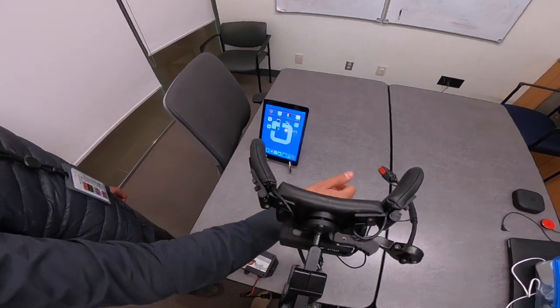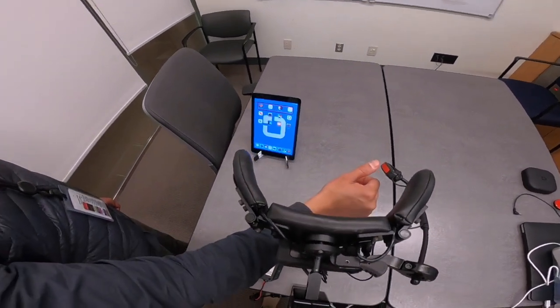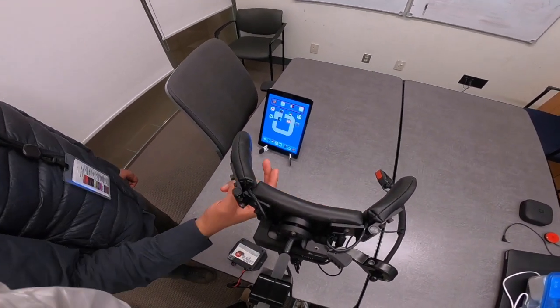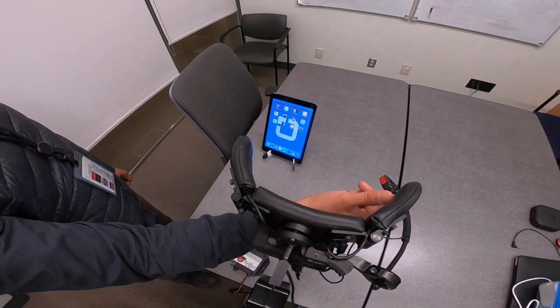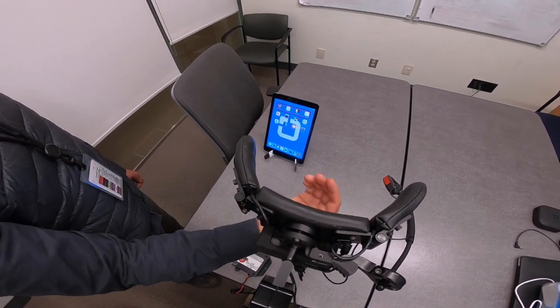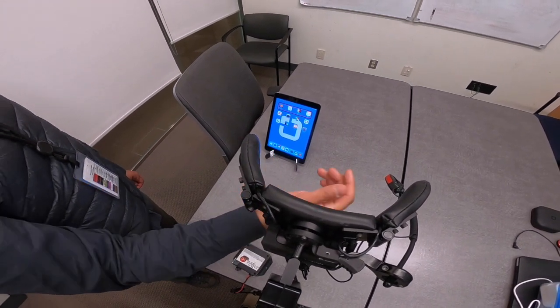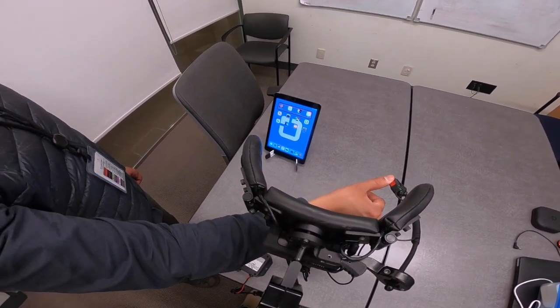But what about the switch located at the front of my head array? Well, when you press your switch at the front of your head array, you can switch wheelchair modes. For example, you can go from wheelchair driving mode to technology control.